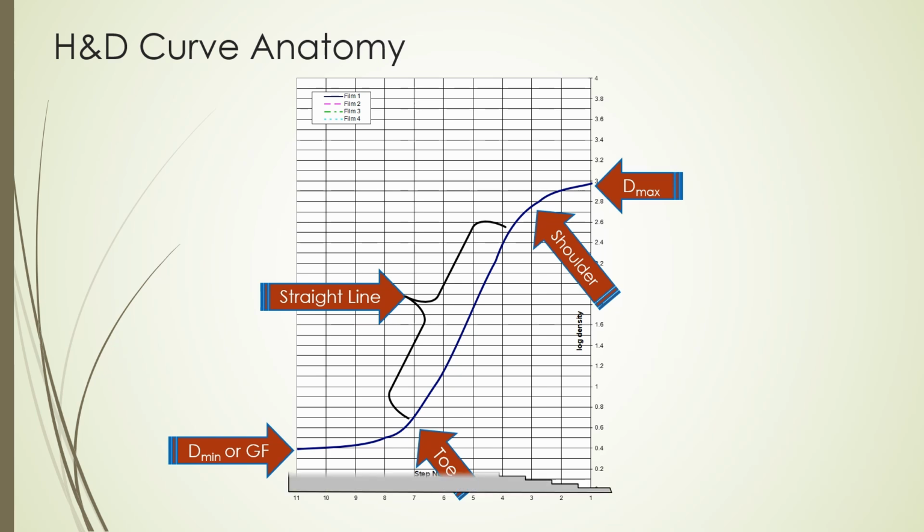Here is how the penetrometer would be oriented relative to the curve, with the thickest step to the left of the curve.